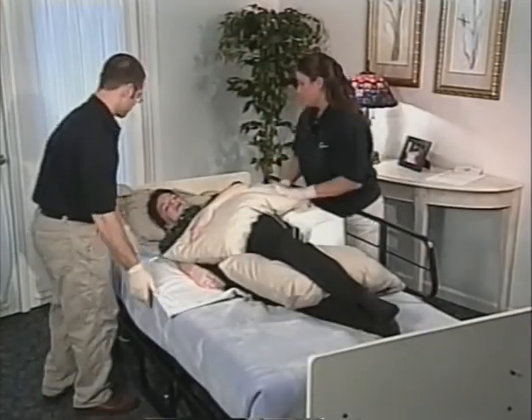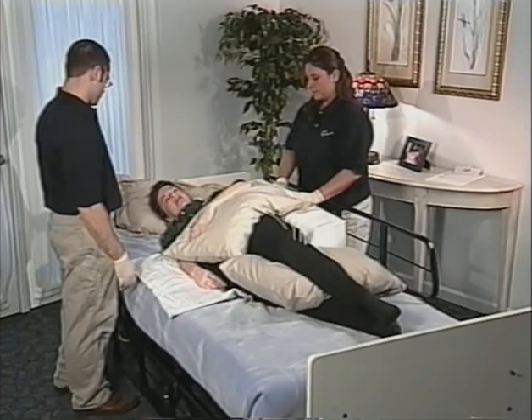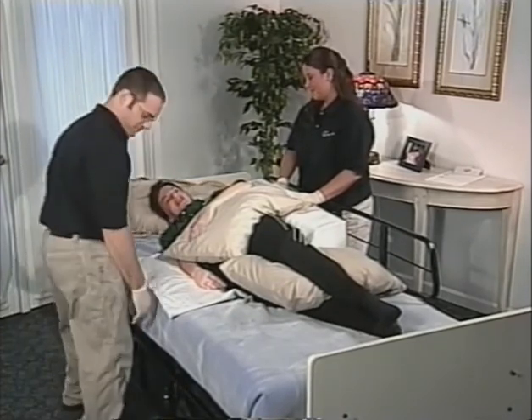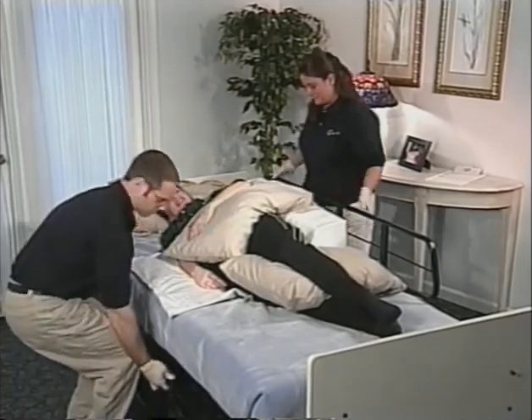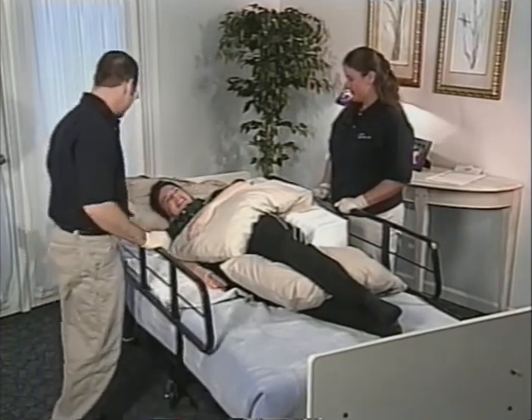Raise the head and foot of the bed. Are you comfortable? Make sure side rails are up and turn on feeding equipment. This is side lying positioning.